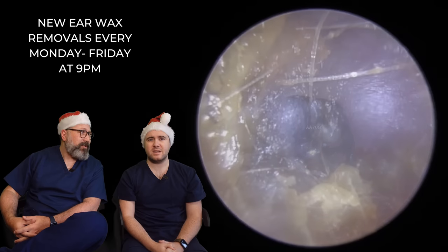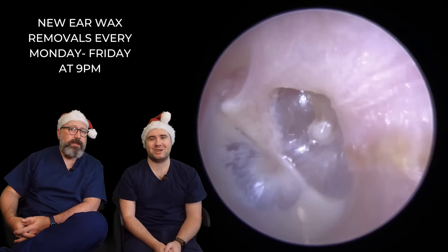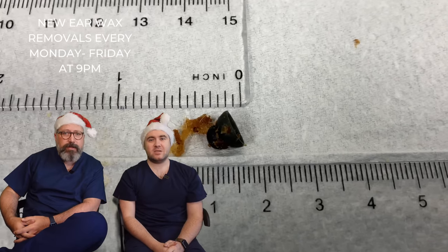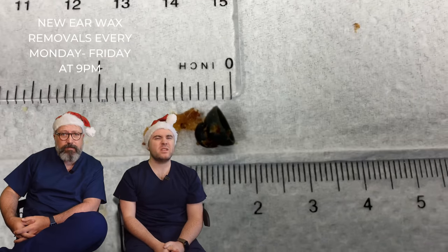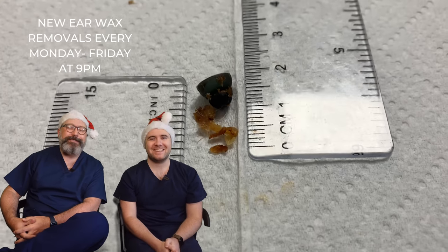That's quite retracted that one. That is quite retracted. A lot clearer now though - much clearer. There you go, looking a lot better. So one and a half centimetres - we'll say one and a half centimetres, three quarters of an inch - including the dome there.